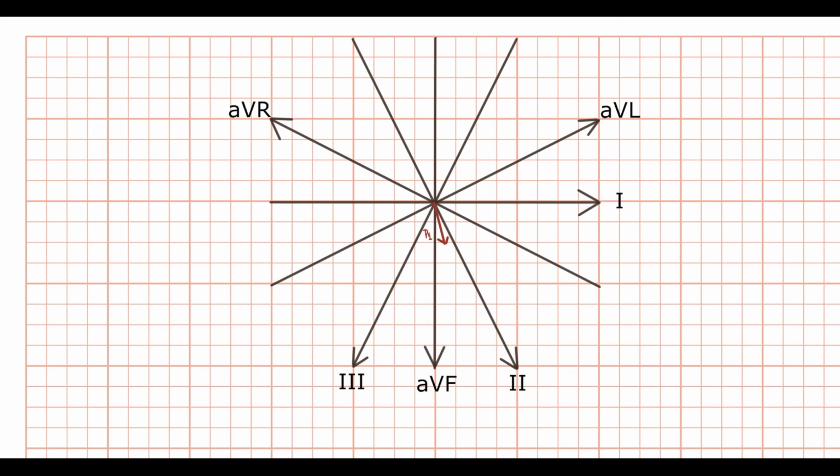And after that the left atrium begins to depolarize, and the vector of left atrial depolarization is located more to the left. Also this vector is bigger due to the greater tissue mass in the left atrium. And to calculate the resultant vector of atrial depolarization, we make a parallelogram from these two vectors and draw the diagonal that will be the resultant vector of atrial depolarization.